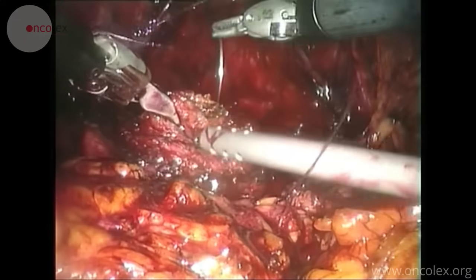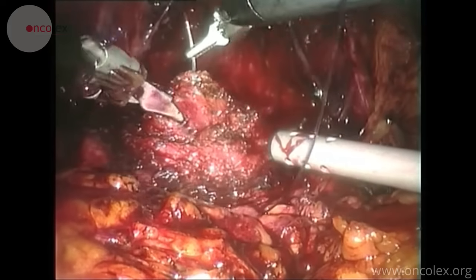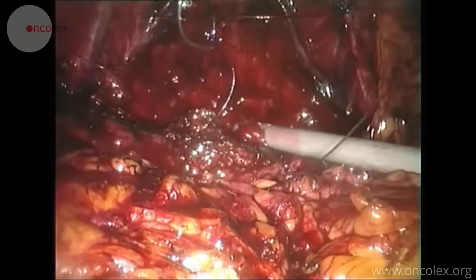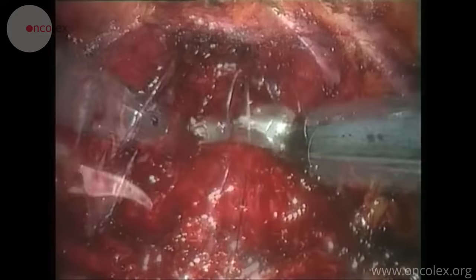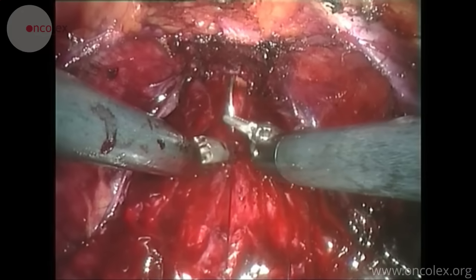The surgeon then begins making the anastomosis with Biosyn 2-0 and a knot in the middle. Continuous sutures are made. This technique is named after a Belgian surgeon named Van Veldhoven and is used by many surgeons around the world.